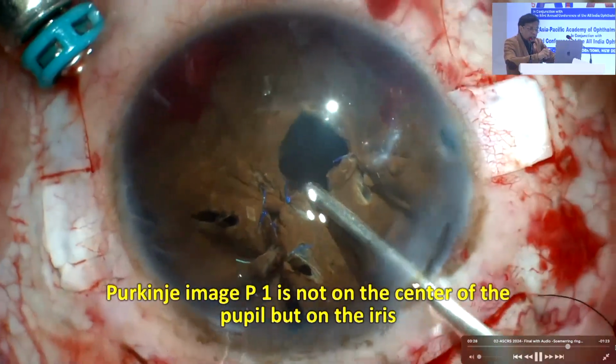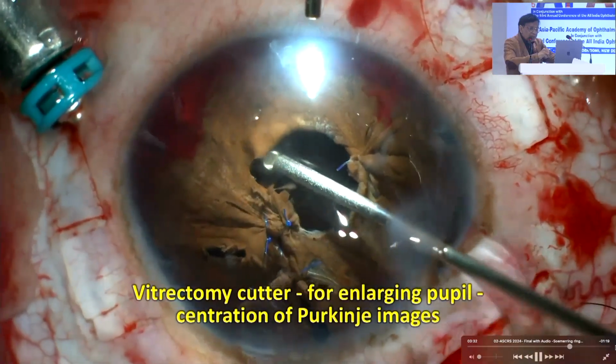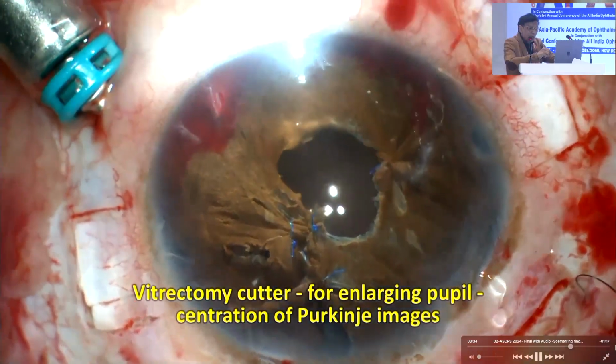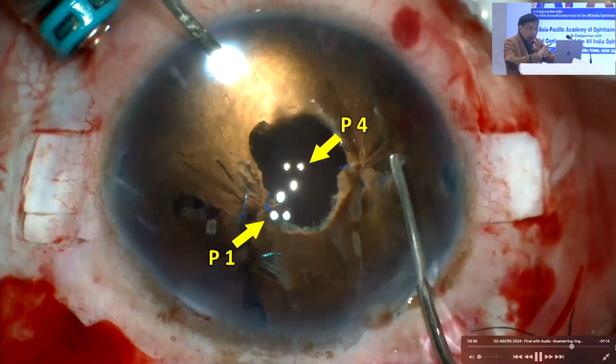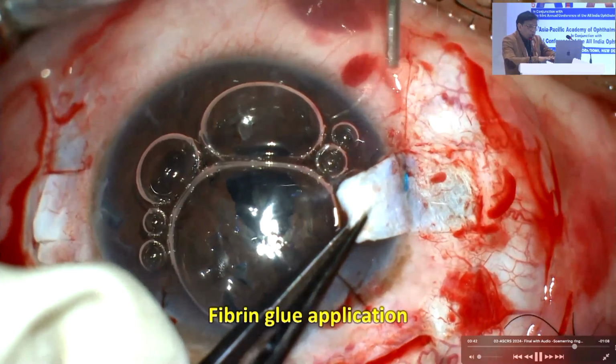Anyway, coming back to this case, I thought to use a vitrectomy probe. See the Purkinje image. That should be bang centered. And look at that Purkinje image. Don't look at the inverted Purkinje image. That is P4. Don't focus on that. Focus on the P1. Now, patient done.